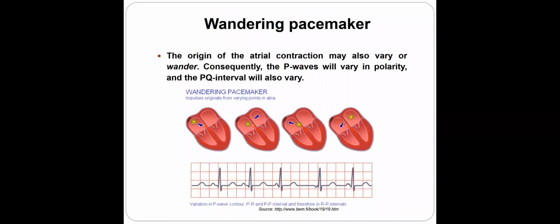Now let's move on. There is another thing that is called the wandering pacemaker. This wandering pacemaker is usually rhythmically coming, and rhythmically it goes from the sinus to the AV. The P wave morphology varies from the sinus to the AV, and that's rhythmically coming and going. What can be the cause? I have no idea what generates it, but sometimes it happens, possibly some kind of oxygenation abnormality affecting the atrium. That can cause the wandering pacemaker activity. It's not too common.